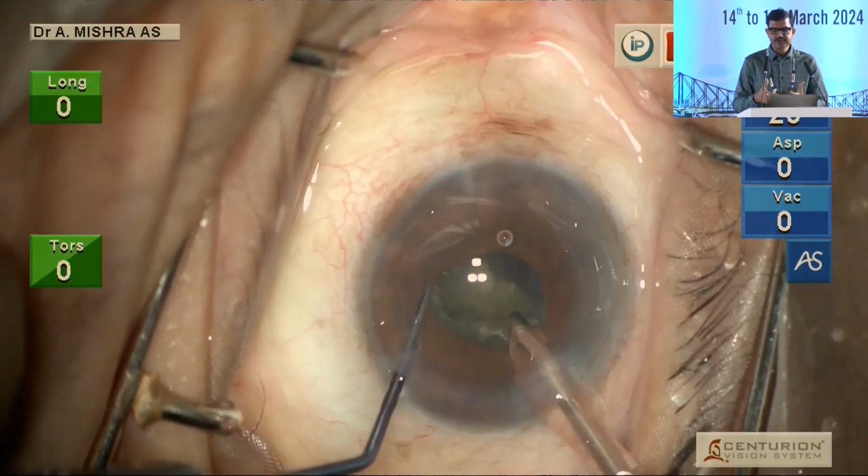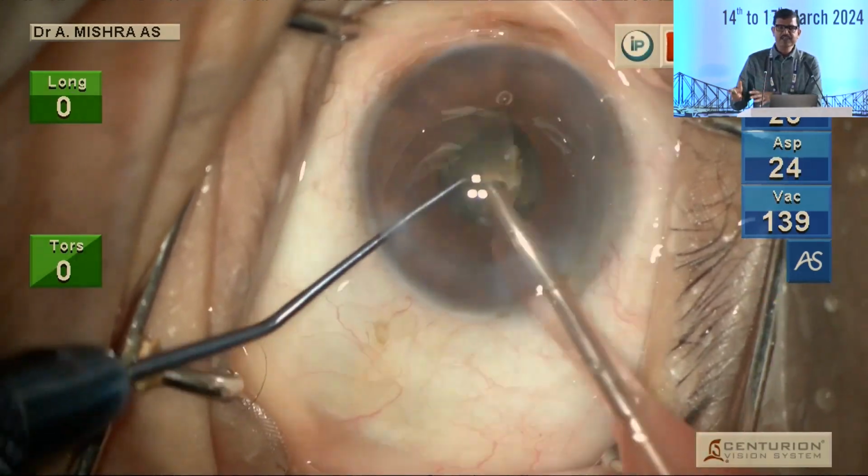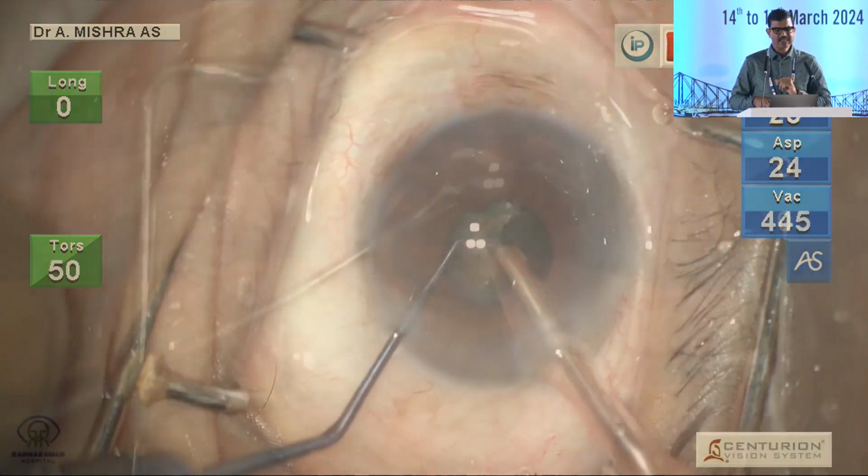This is an unedited video, and I just wanted to show you that it's not very difficult to manage the nuclei, even in the presence of hard nuclei, in the majority proportion of our cases. So whenever we can, we should.